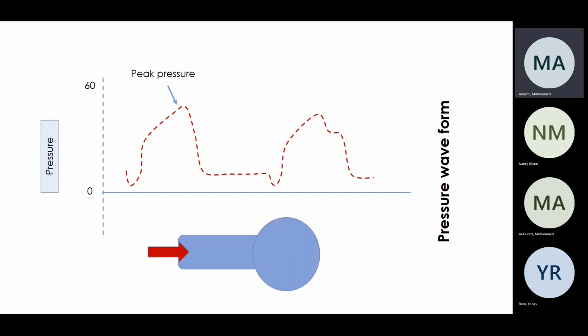And then we said that's when the peak pressure goes inside the alveoli and we stop. If I ask you to take a deep breath and hold it, then there is no flow going in.